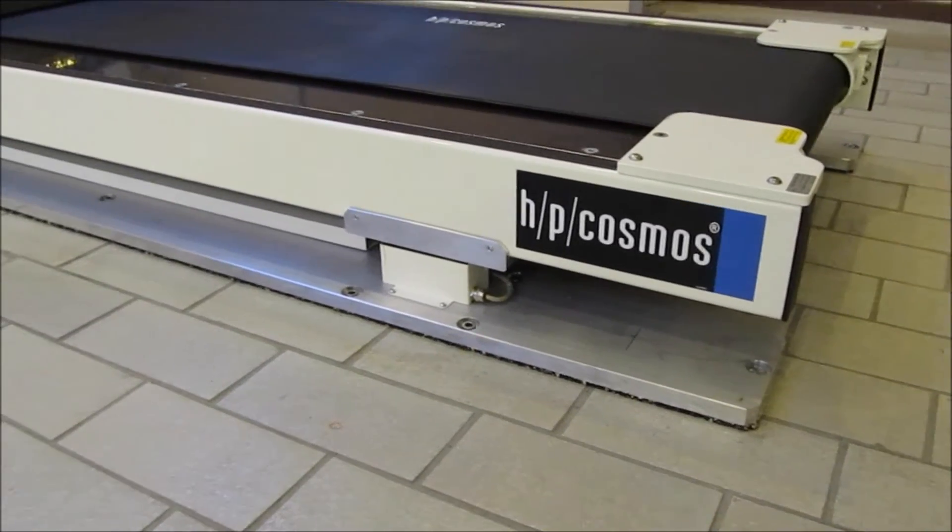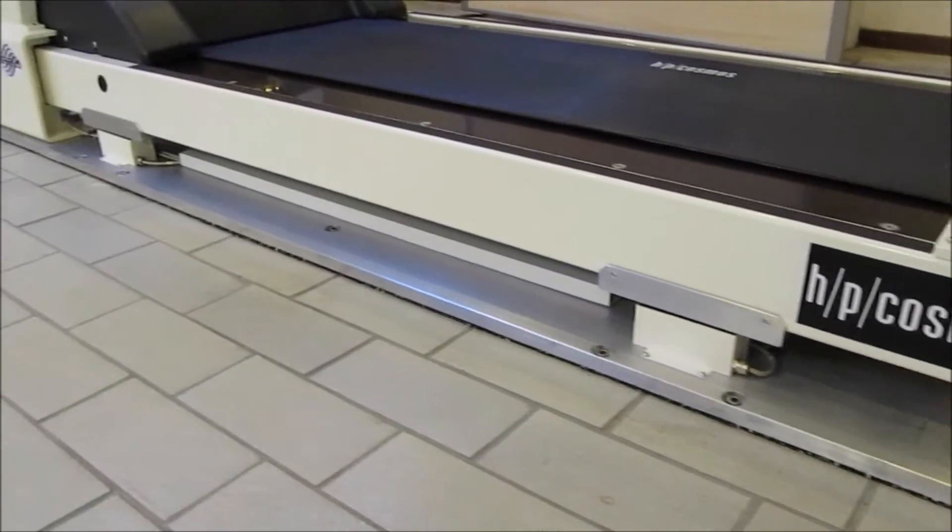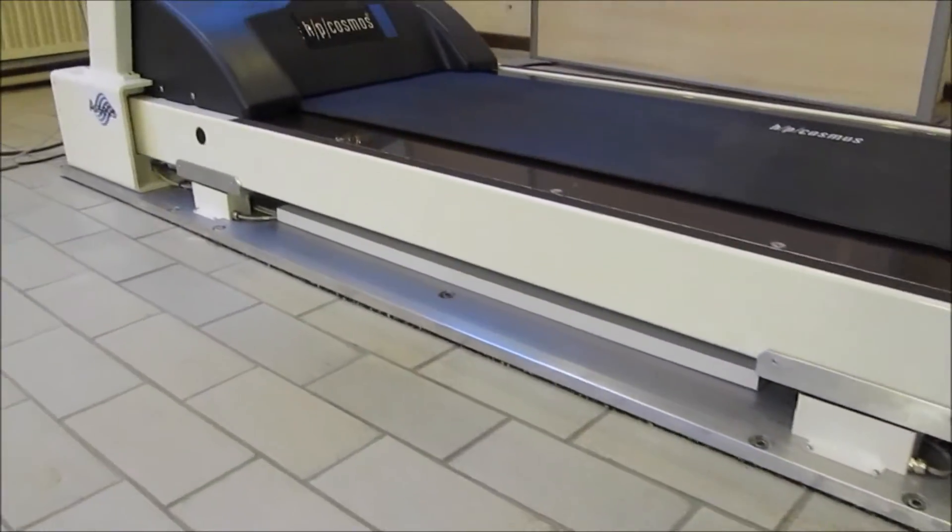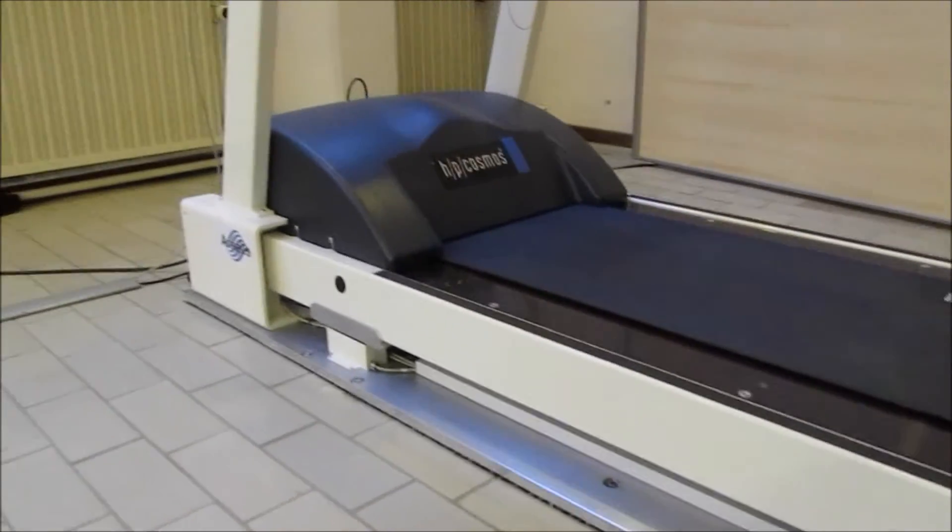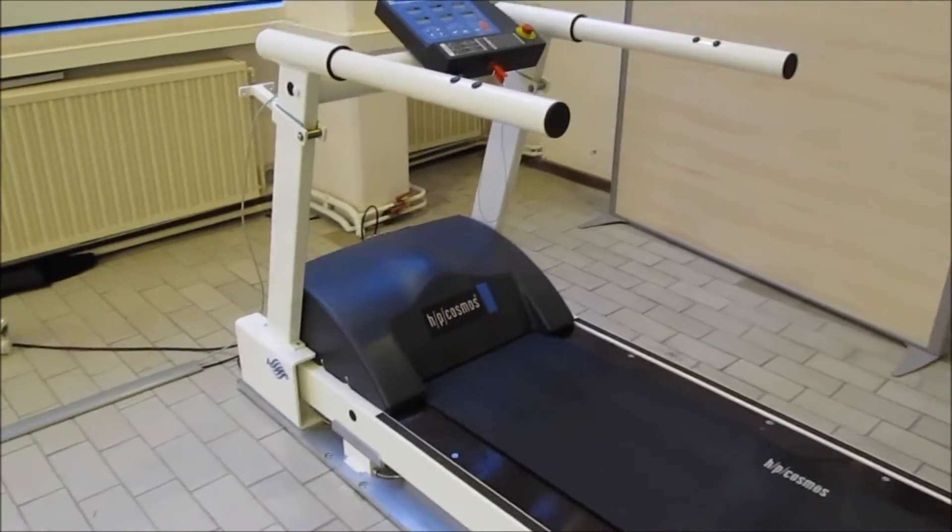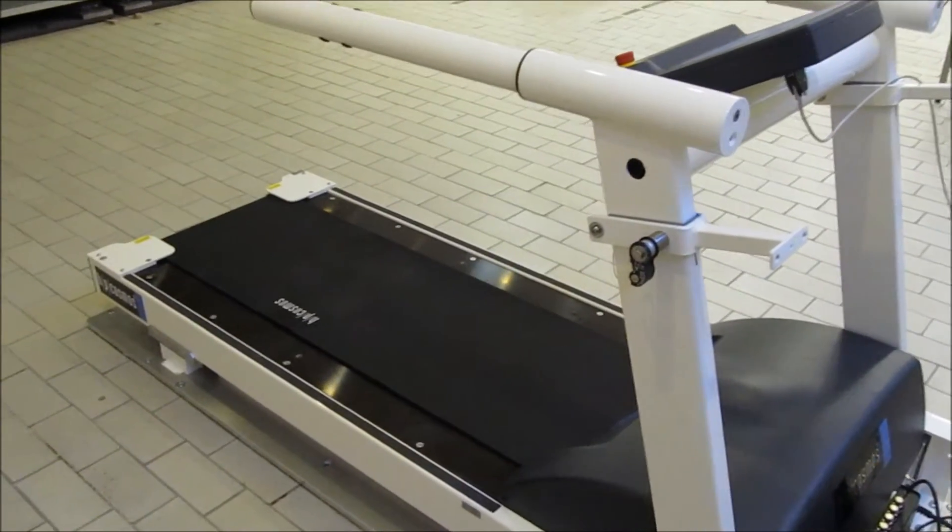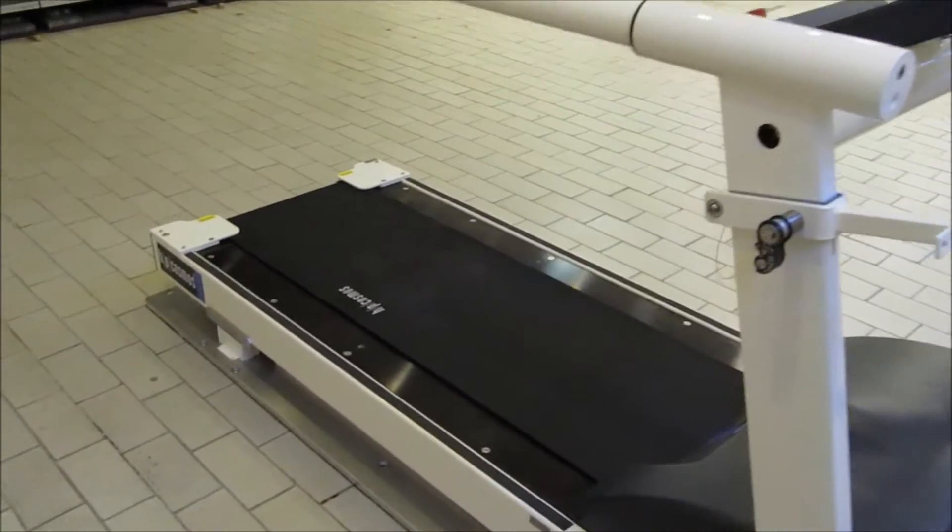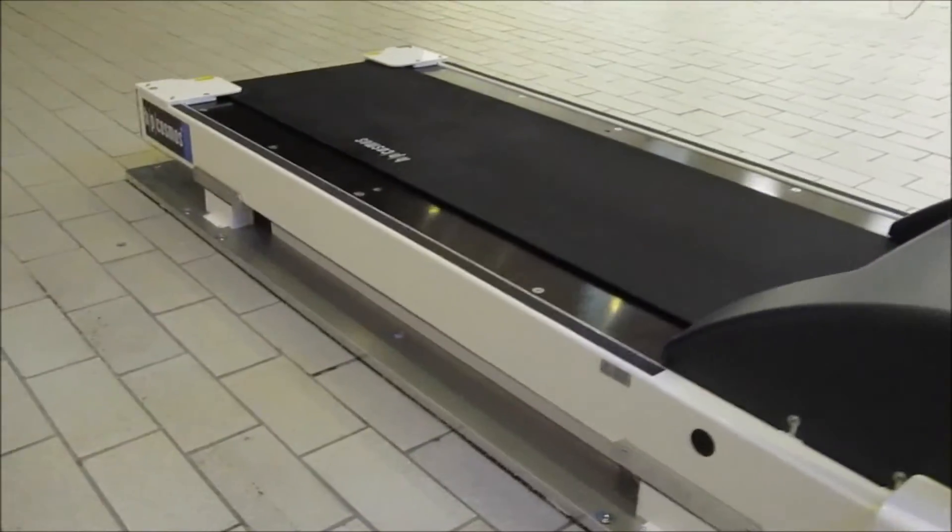The treadmill feet and elevation system are replaced with 3-dimensional load cells that can measure forces up to 1 ton in each direction. The load cells are mounted to a dedicated frame that is bolted to the floor.